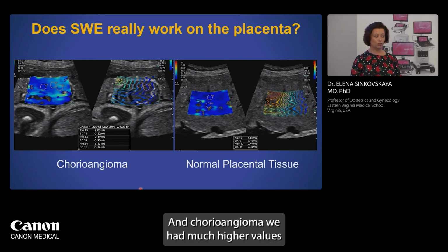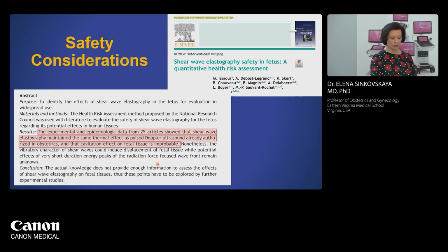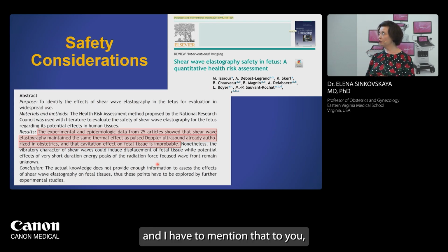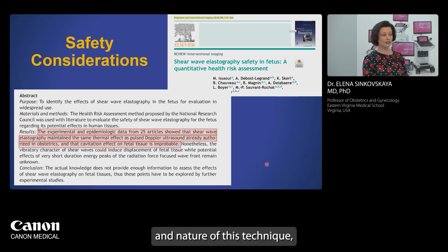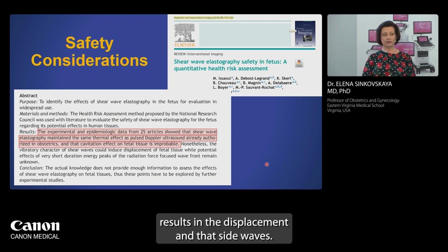And for chorioangioma, we had much higher values of the shear wave elastography. So the other very important aspect, and I have to mention that to you, because that's the physics and nature of this technique, it pretty much includes the sending of the pulse that then results in the tissue displacement and shear waves.